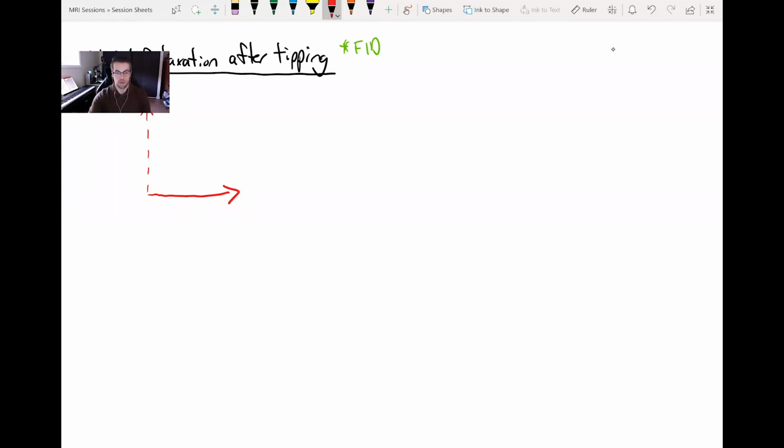Okay, so to answer my own question about how we're going to measure the net magnetization vector, one answer is that we record it through magic. And the other more correct answer is that we measure it using a very important physical principle called Faraday's law.